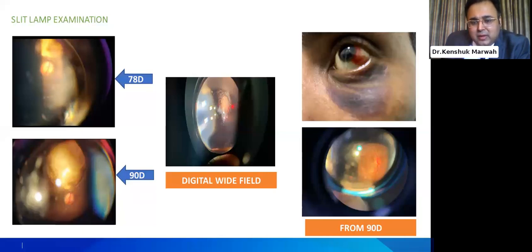So this is the clinical aspect of what we are doing with the lenses, what we are observing. And on the follow up, if I'm not there as a retina specialist, my colleague, if my wife is also seeing a patient, they can see the patient that has been lasered very nicely on a slit lamp. So these images are taken on a slit lamp, and it gives a very good view of actually how the magnification is, what you are actually looking at. So this is a very good example.